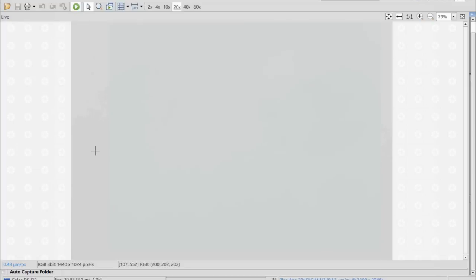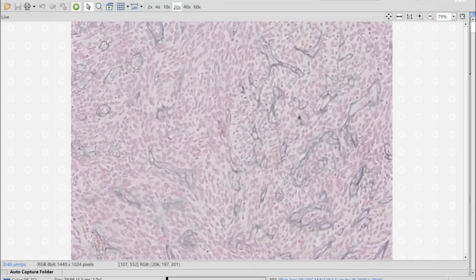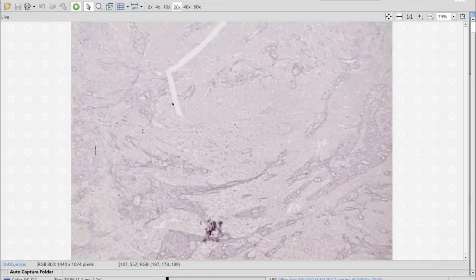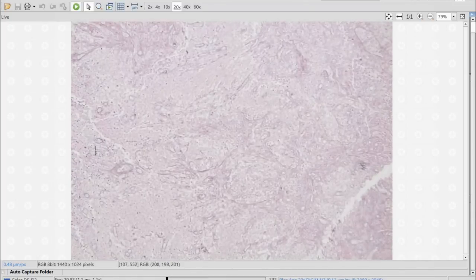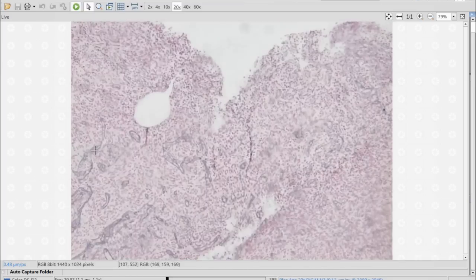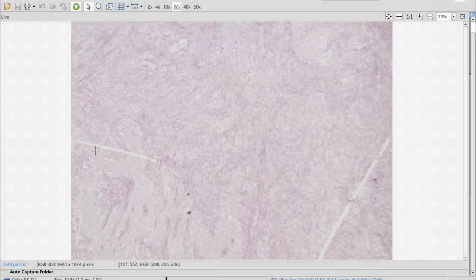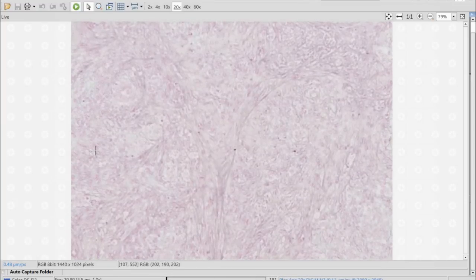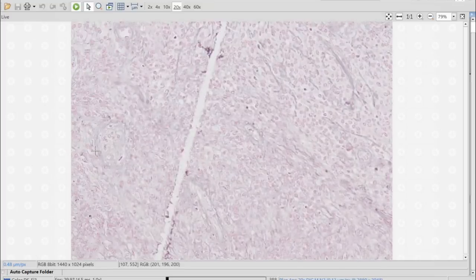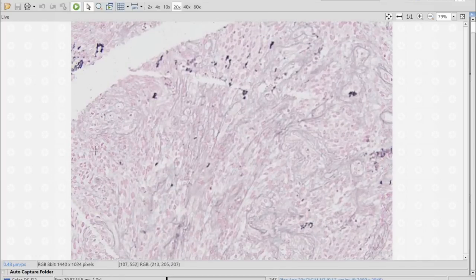But something that was helpful in this case, and that we still use in many different contexts, is your reticulin staining. So there are areas here that are more convincingly ependymal that have essentially not much reticulin staining outside of the vessels, but then you have increased reticulin deposition in others. Particularly here. So this is pericellular reticulin deposition, in some of the more mesenchymal appearing regions.